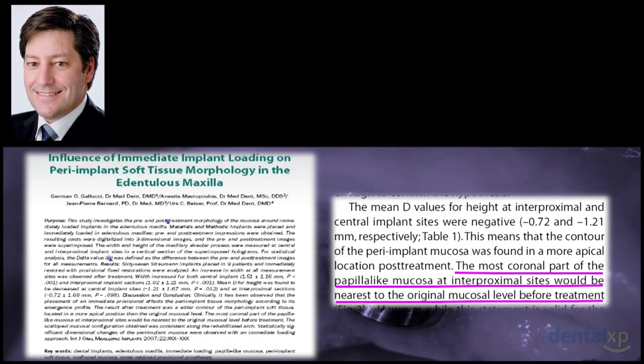If there is no tooth structure, you cannot have an interproximal papilla. So you can only work within the thickness of the edentulous mucosa, and that has to be planned, because if you have an edentulous patient with a very thin mucosa, you may not have that room. And then you will need to move on into a pink prosthetic design, as I will show you in a moment as well.